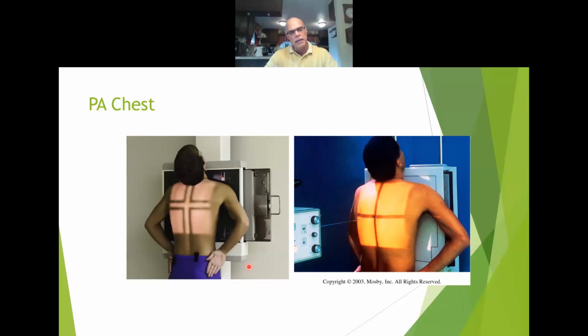If you can't see it, then you have some underexposure. Honestly, it's not going to be a problem in your DR world because the computer can help change your window level and window width, so technologists or the radiologists are able to play around with that in order to see all these different areas and tiny details within the lung cavity itself.